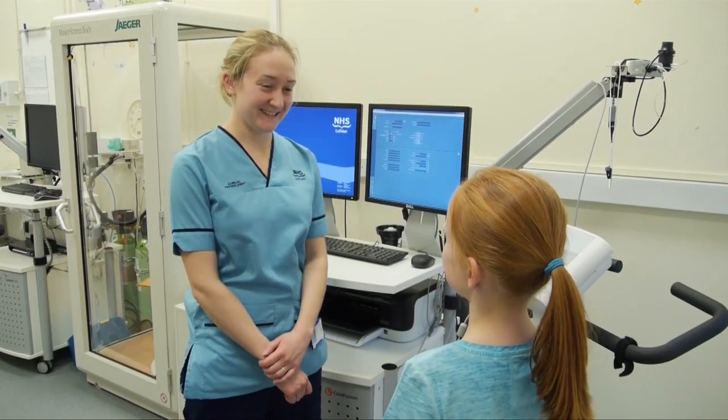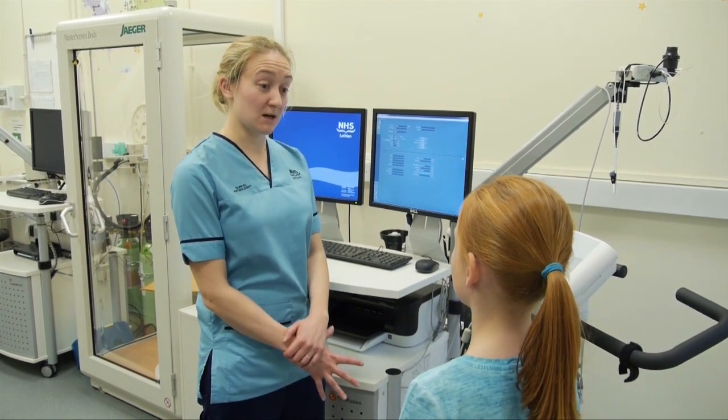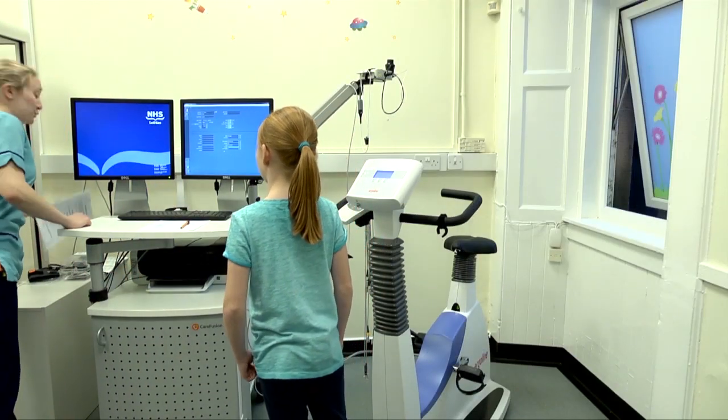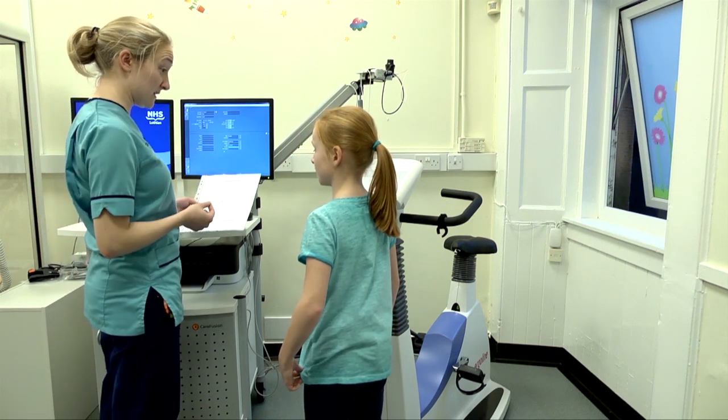Why would I need this test? So this test is going to tell us about how your body works when it works really hard when you're exercising. Now, I have two questions that I'm going to ask you now and I'm going to ask you again at the end of exercise.